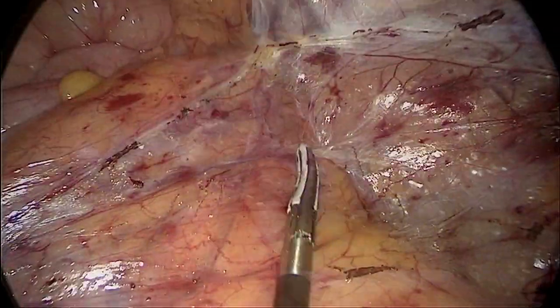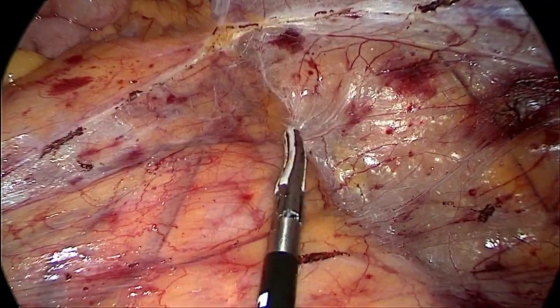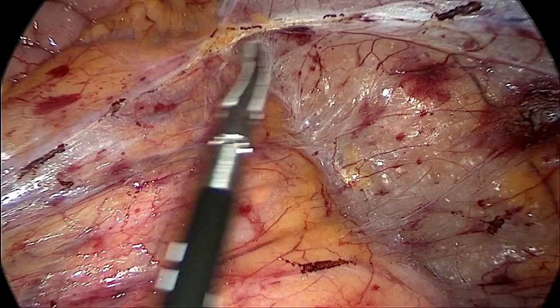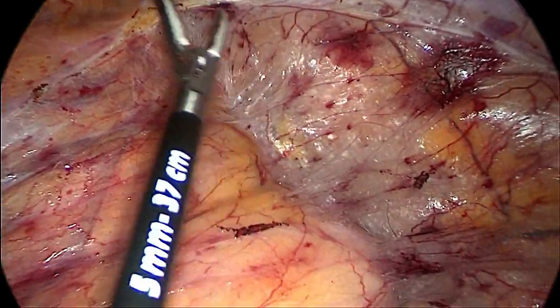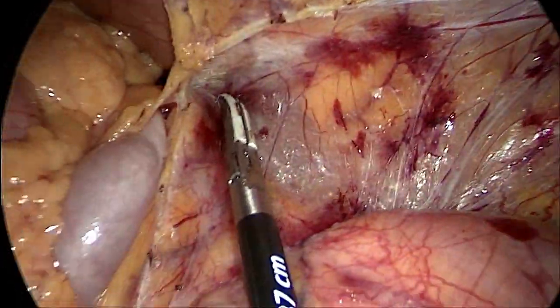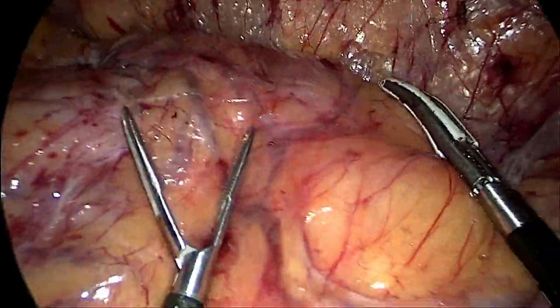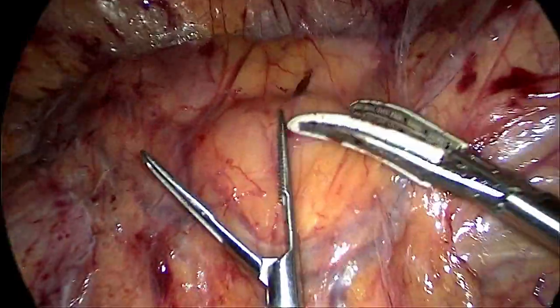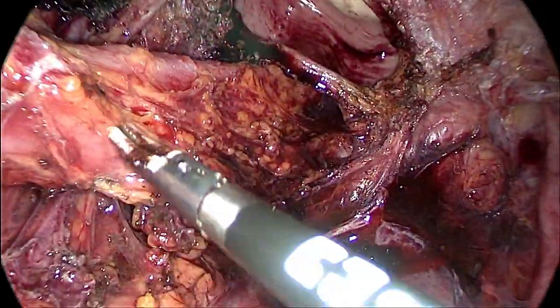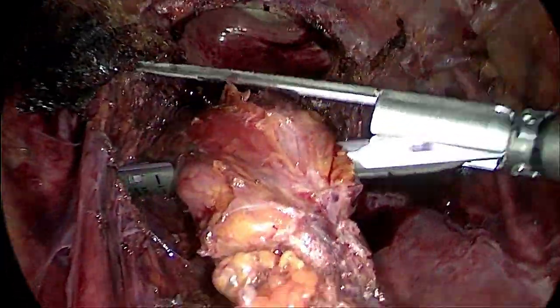For resection of intestinal lesions, the mobilization of the left paracolic gutter was performed, followed by partial mobilization of the splenic flexure. Dissection of the rectum was then performed with posterior stapling of the segment.